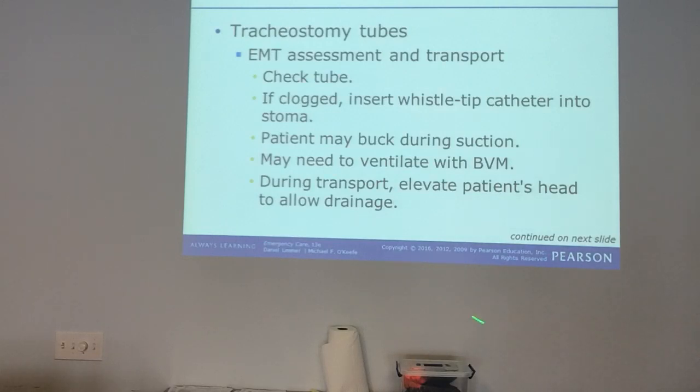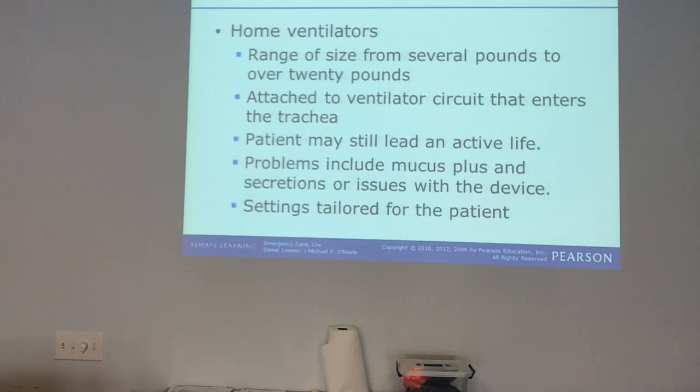This is really important, okay? If you get a person with a lot of stoma goo or gunk, and it is gunky, it's nasty, you may have to sit them up and get them taken care of, okay?